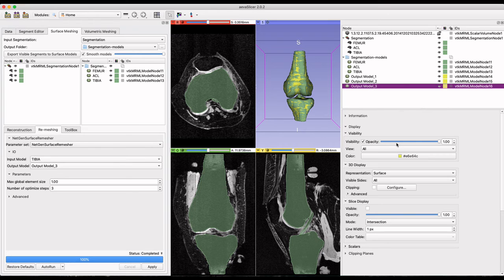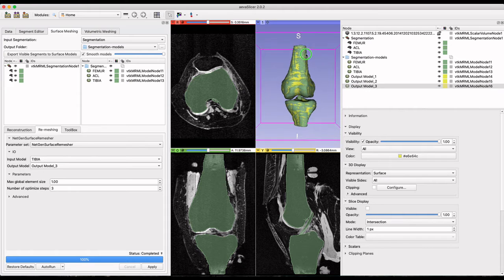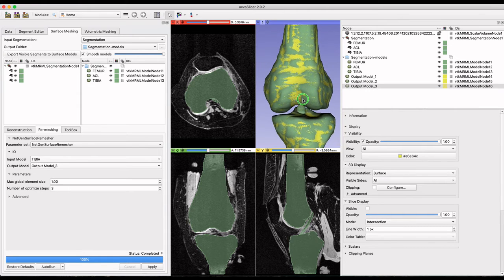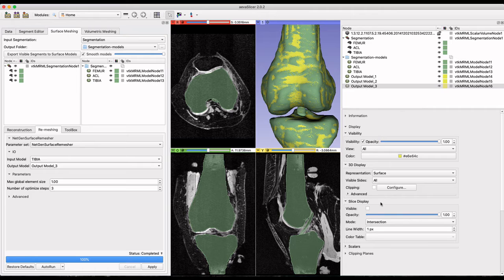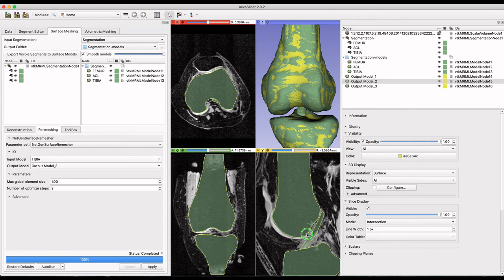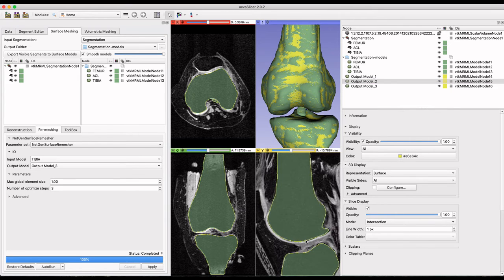The outputs will appear to the right among the rest of the data. To view the remeshed surfaces and compare to the original segmentations, you can change the visibility to a surface with edges. This view also displays the triangulated surface when visibility of the original geometry is turned off.